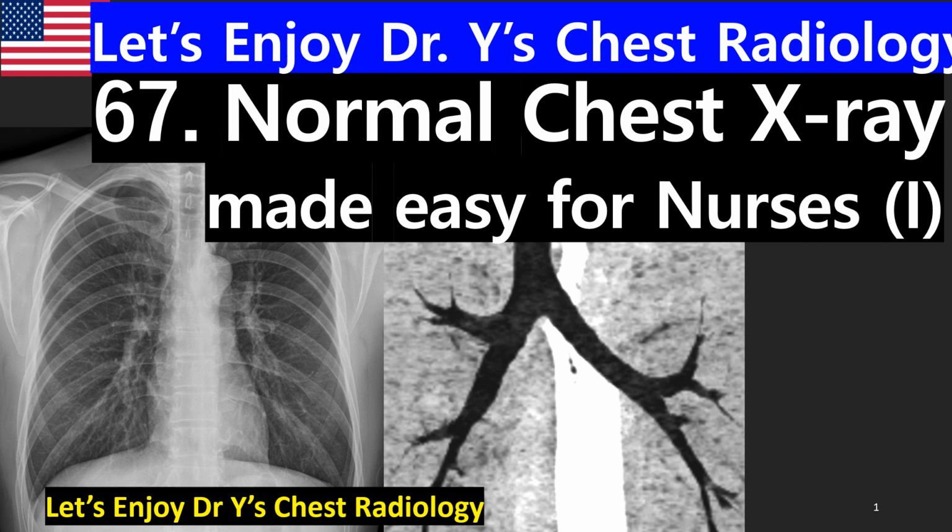Today's lesson 67, normal chest X-ray, made easy for nurses, part 1. This is made for the hard-working nurses all over the world in the hospital. Let's go.